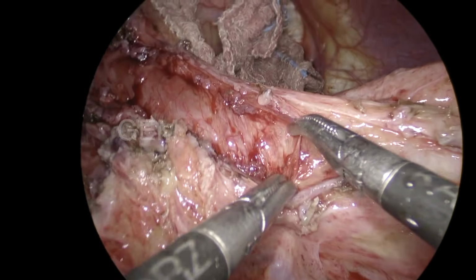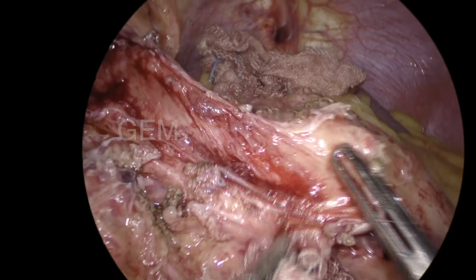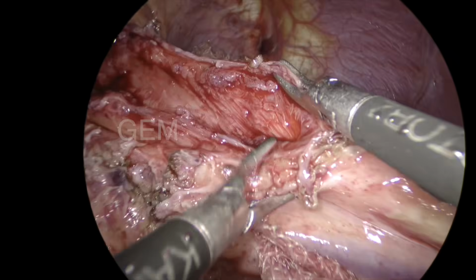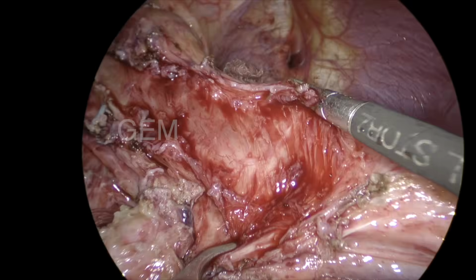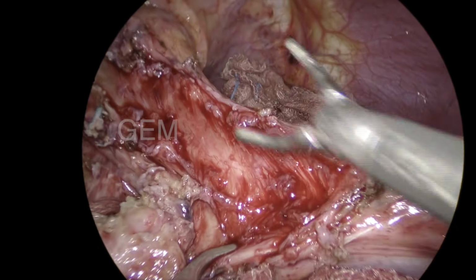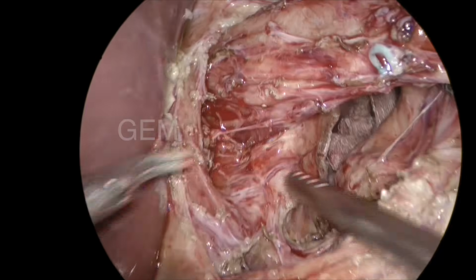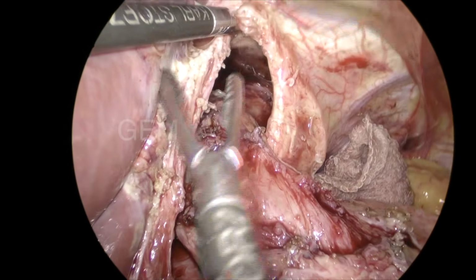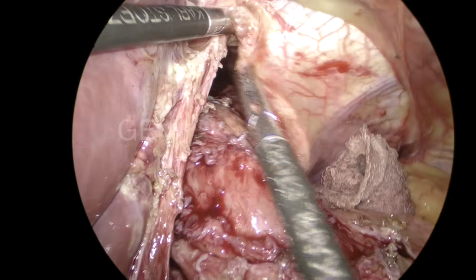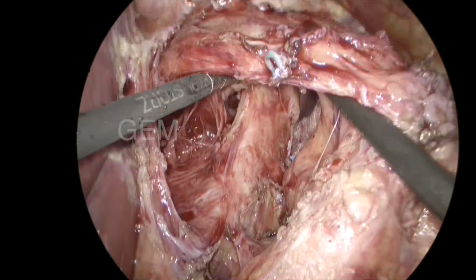So I'm extending my myotomy, because a redo surgery should always have around 3 centimeters of myotomy on the gastric side. So this is called extended gastric myotomy. Now everyone is convinced, as the mucosa of the esophagus, the OG junction, and the gastric side are exposed. And I'm checking for crural approximation, because the patient already had a hiatus hernia.